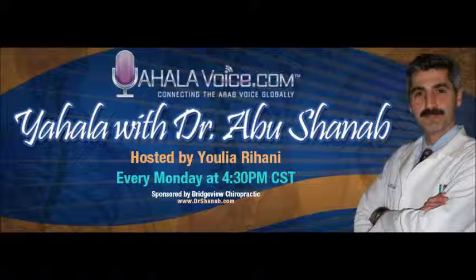Okay, first of all, I would like to explain what an MRI is. MRI is magnetic resonance imaging. It's a modality that does not have radiation. It's very safe. And it could be performed in young children and even in pregnant females after their first trimester.